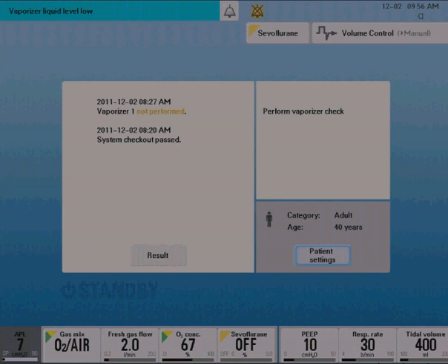In this short video, I'm going to try to demonstrate the mimicking of airway pressure release ventilation in the Flow-i anesthesia delivery system. As you notice, I started with volume control ventilation, and these are pretty much generic ARDSNet settings for a patient with ARDS.